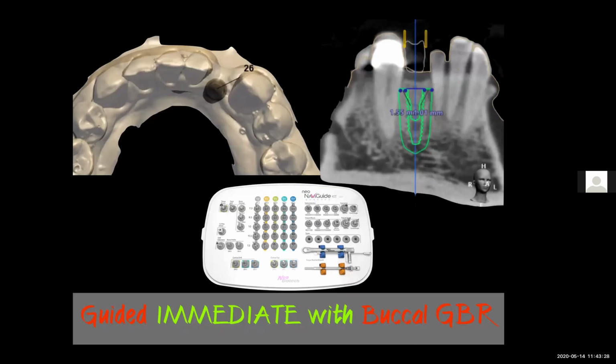The final case I want to show you today involved guided implant surgery for a missing tooth number 26 that has a moderate buccal wall defect with limited mesial-distal edentulous space. If the implant in this case encroaches on the area of tooth number 25, the risk of developing periodontal defects and losing tooth 25 is high. So in this case, precision is an absolute must.